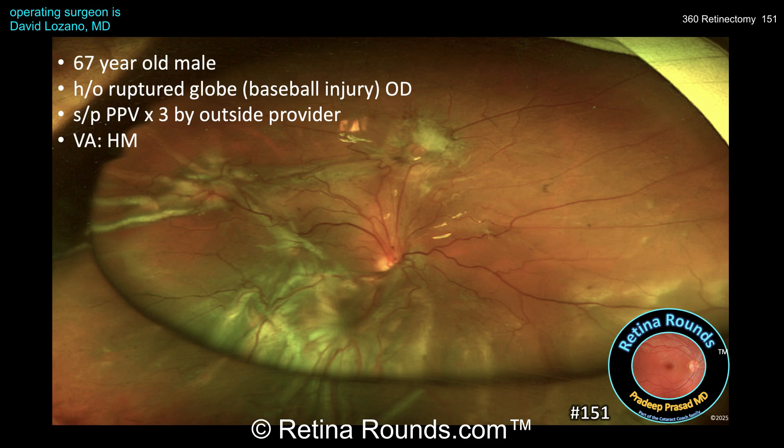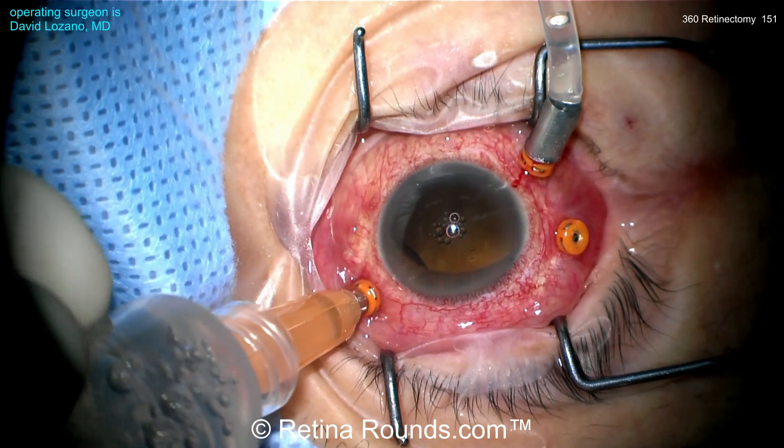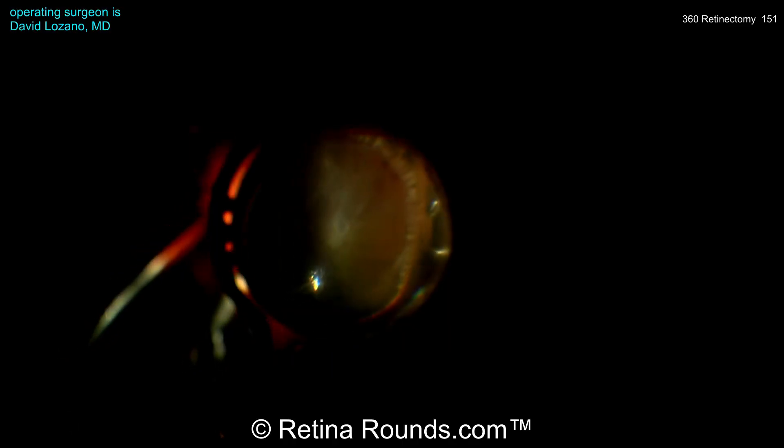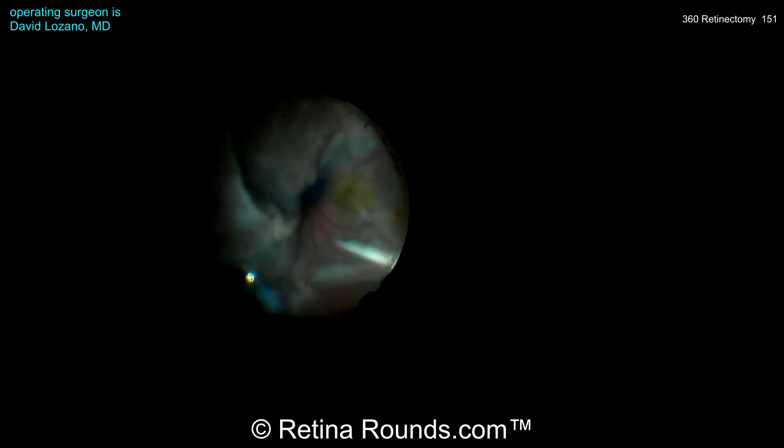The patient had previously undergone a lensectomy and was left aphakic. Dr. Lozano is using a 23-gauge vitrectomy setup, and he's going to start by removing the residual silicone oil in the posterior segment. You'll also notice that there appears to be some areas of iris retraction, which can be an indication that there is significant anterior PVR and/or a residual capsule fused to the posterior surface of the iris, and that will need to be addressed.